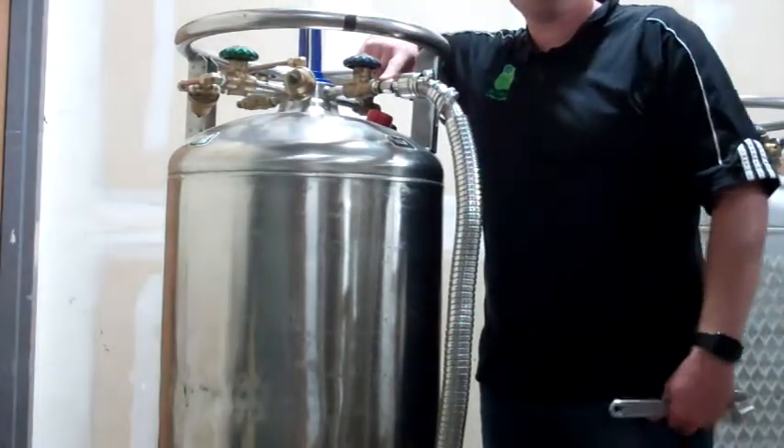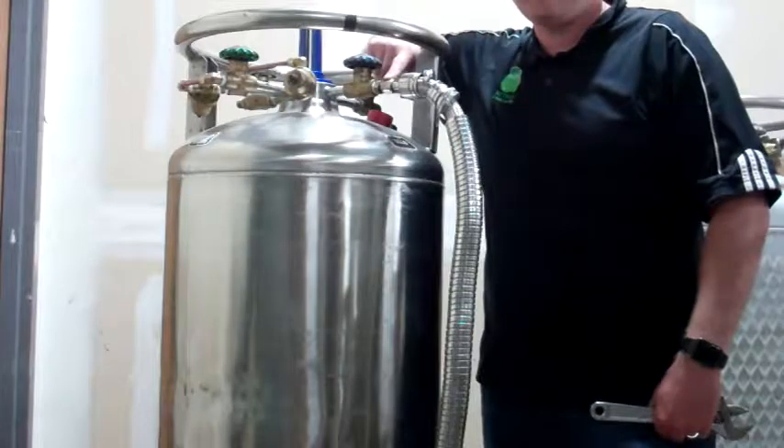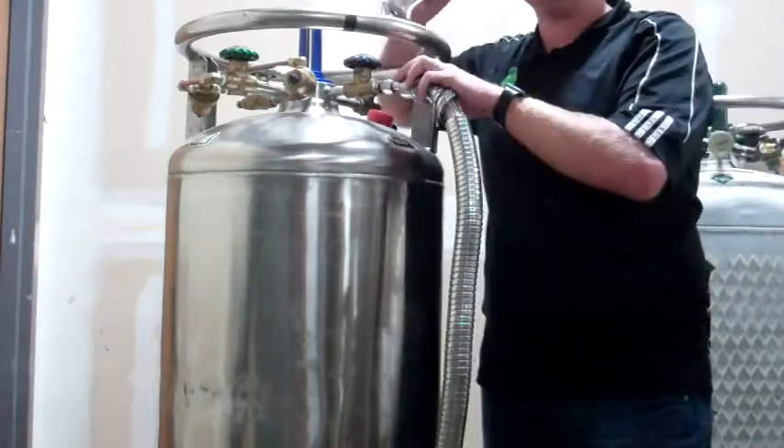Do not tighten this hose too tight. If you tighten it too tight you won't be able to get it off. What will happen is this brass fitting will come off inside of this hose.